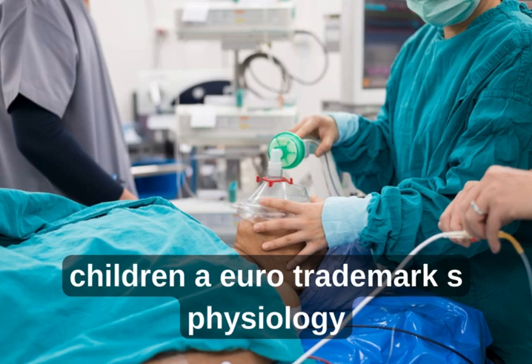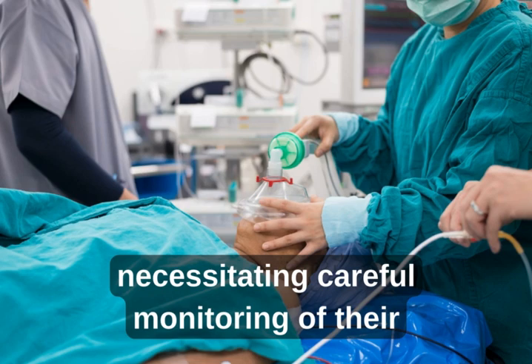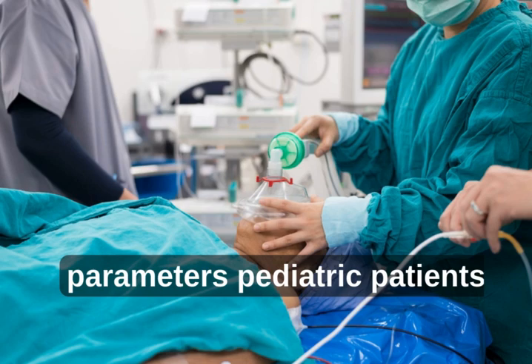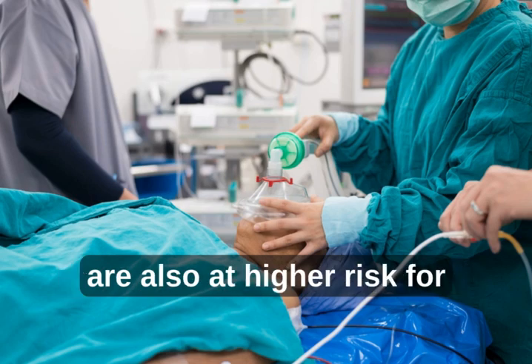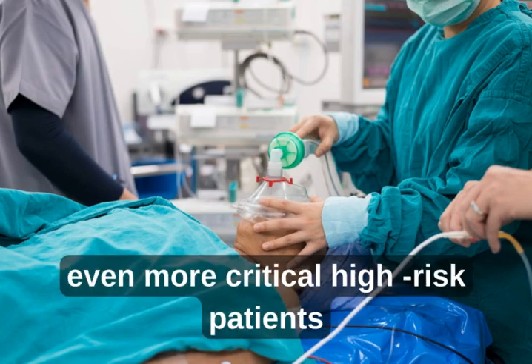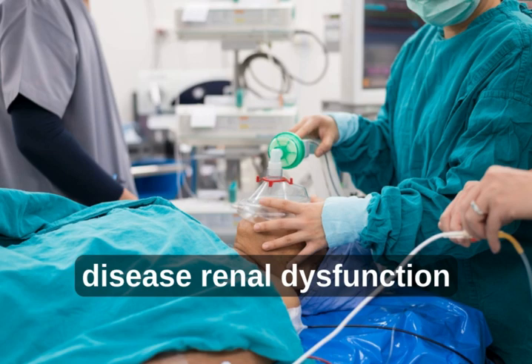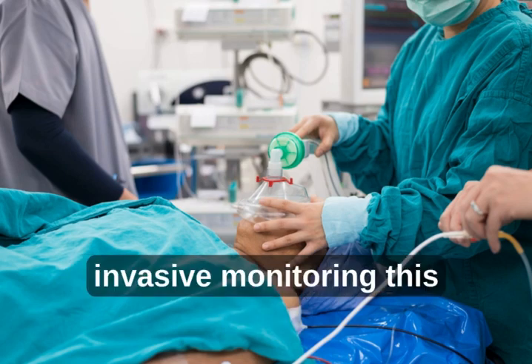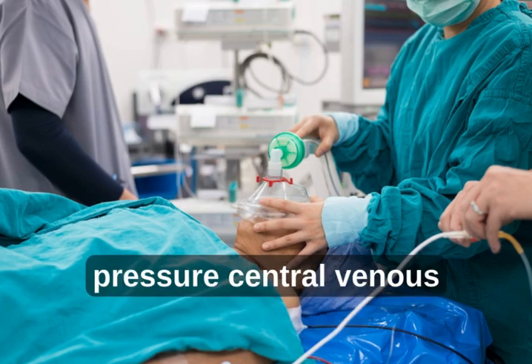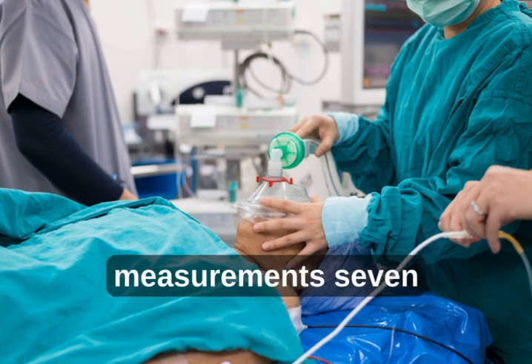Pediatric patients, children's physiology differs significantly from adults, necessitating careful monitoring of their ventilation and cardiovascular parameters. Pediatric patients are also at higher risk for hypothermia, so temperature monitoring is even more critical. High-risk patients, those with comorbidities like cardiovascular disease, renal dysfunction, or respiratory issues often need invasive monitoring. This may include continuous arterial blood pressure, central venous pressure, and advanced cardiac output measurements.